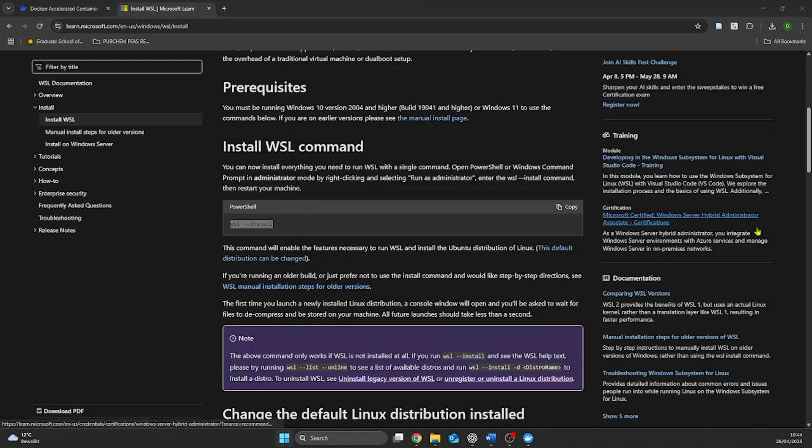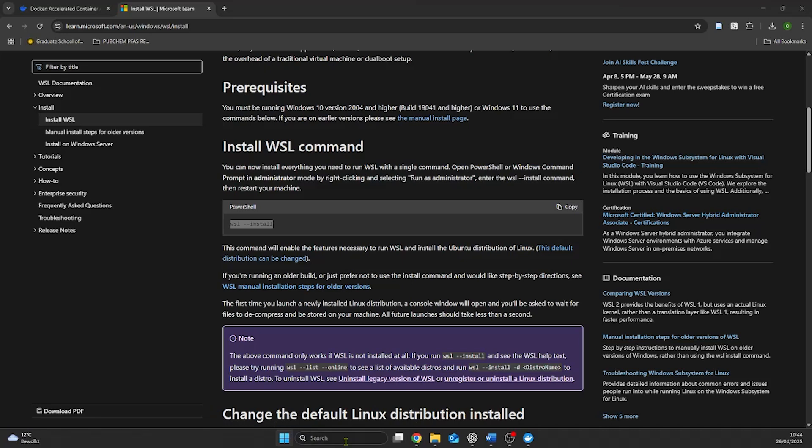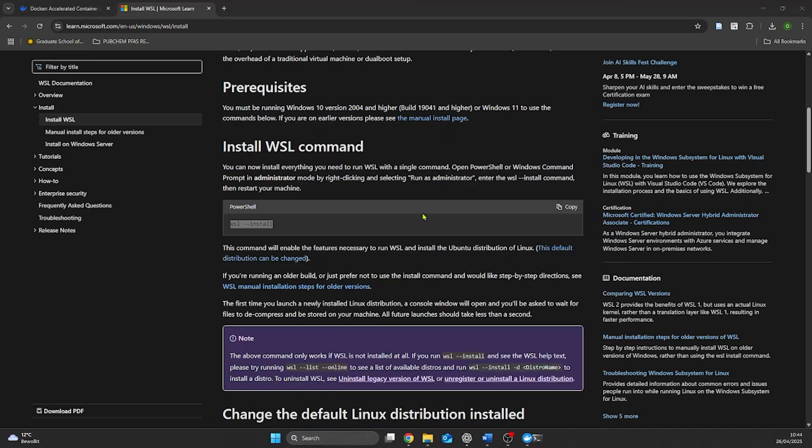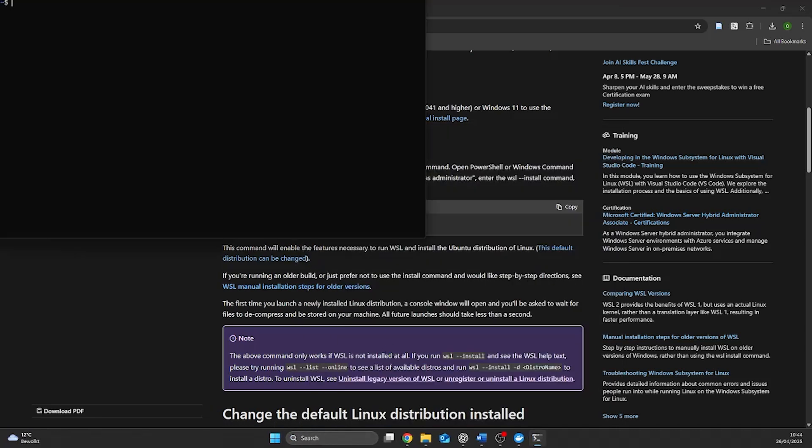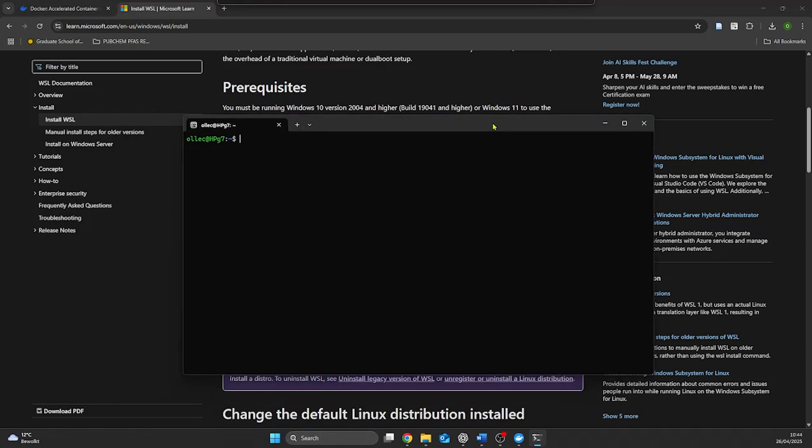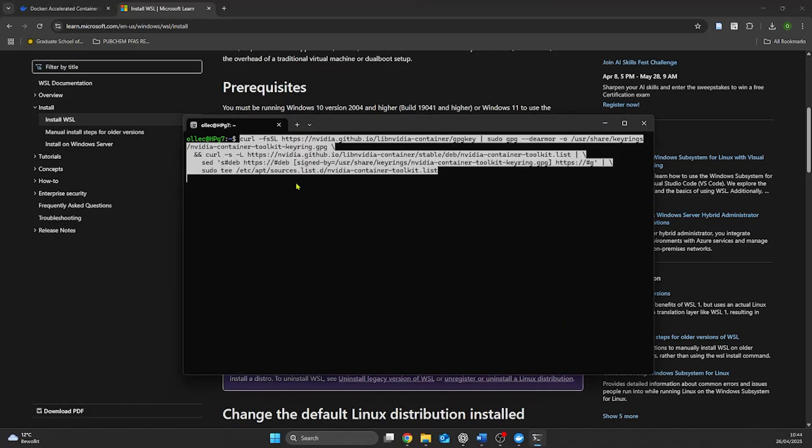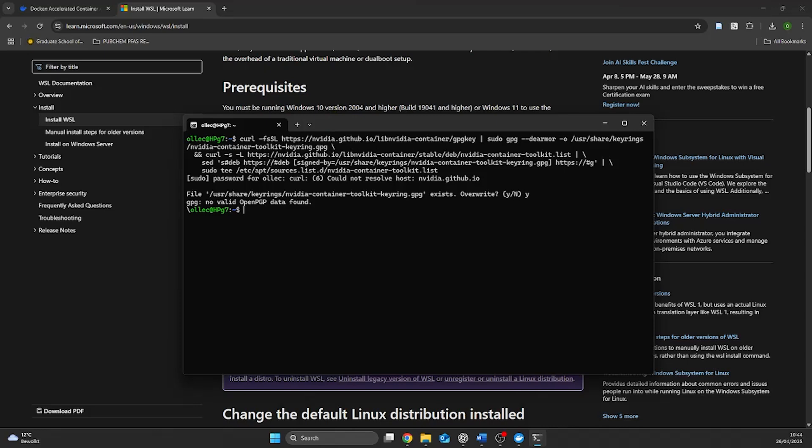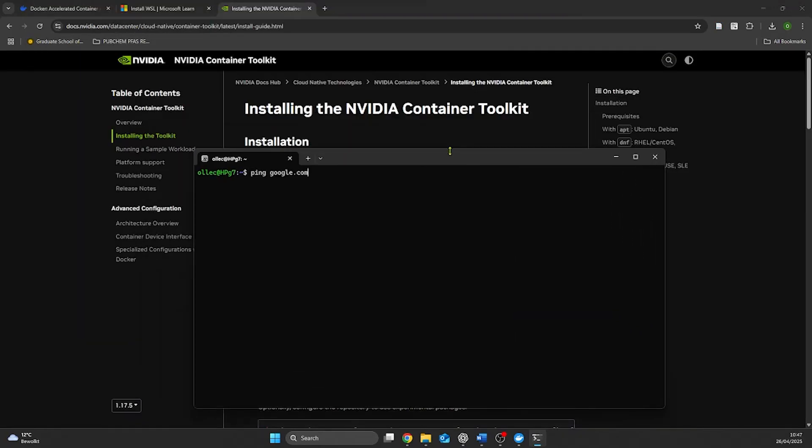After installing WSL we can start installing the NVIDIA Container Toolkit necessary to enable GPU support. When first attempting to retrieve the container toolkit from GitHub I get the error no valid OpenPGP data found. This error shows due to the fact that WSL cannot connect to the internet. If we ping Google we can see that it doesn't work.